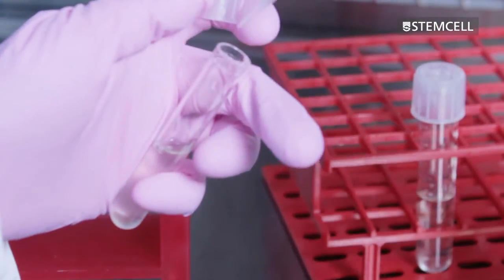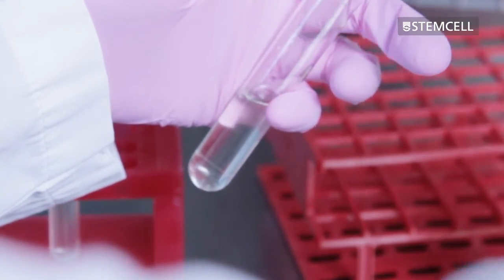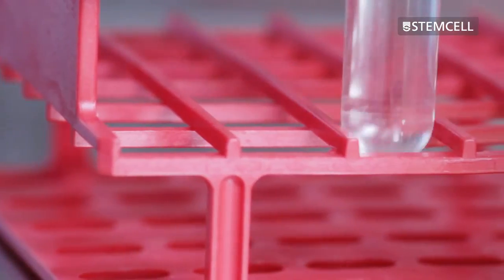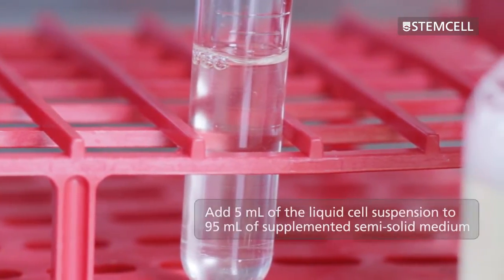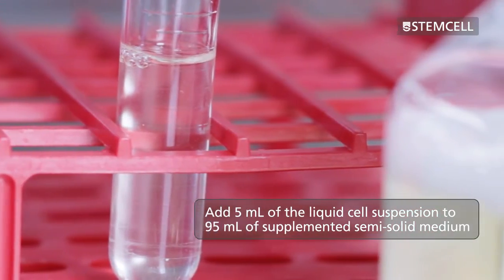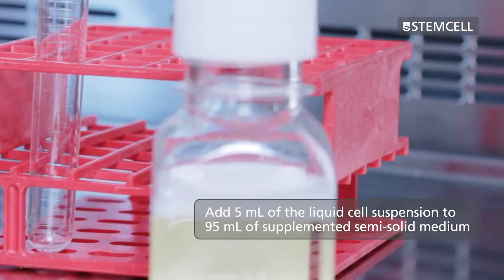Add the calculated volume of cells to an appropriate volume of Clonacell CHO CD liquid medium. You should have a total volume of 5 millilitres of cell suspension to be added to the bottle. Add 5 millilitres of the liquid cell suspension to the 95 millilitres of supplemented semi-solid medium in the bottle.